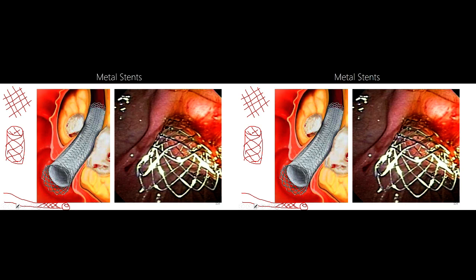Okay? Now, in your studies, when we talk about vasculature next week, and also over the next few years when you start your angiography studies, we're going to be talking about stents quite a bit. And most of the time in vascular studies, a metal stent is what we're talking about. But at the end of the day, it's a roll of chicken wire, okay, with the pure intention of pushing a tube outwards. So, collating all our knowledge together.